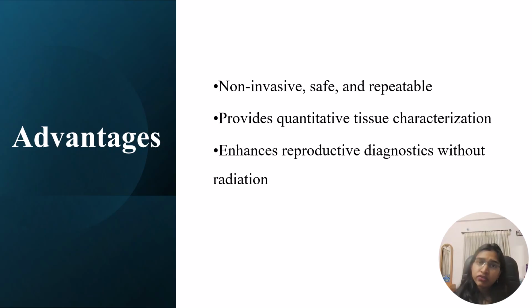What are the advantages of it? Advantages are it is non-invasive, it is safe to use, and definitely repeatable. It provides quantitative tissue characterization and it enhances reproductive diagnostics without exposure to radiation.